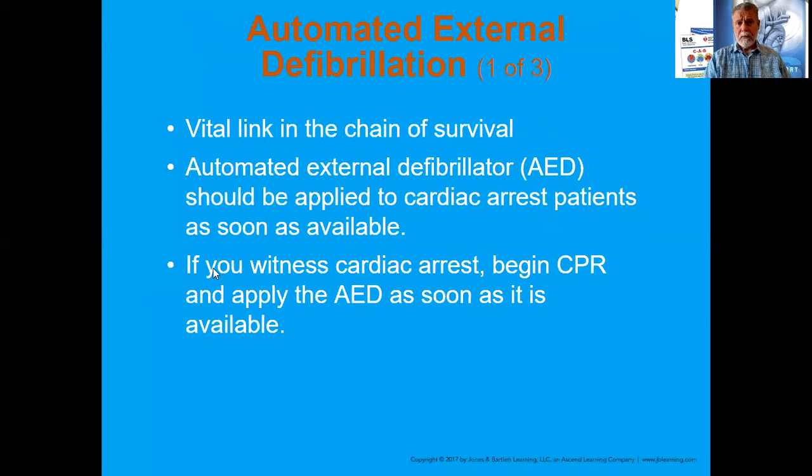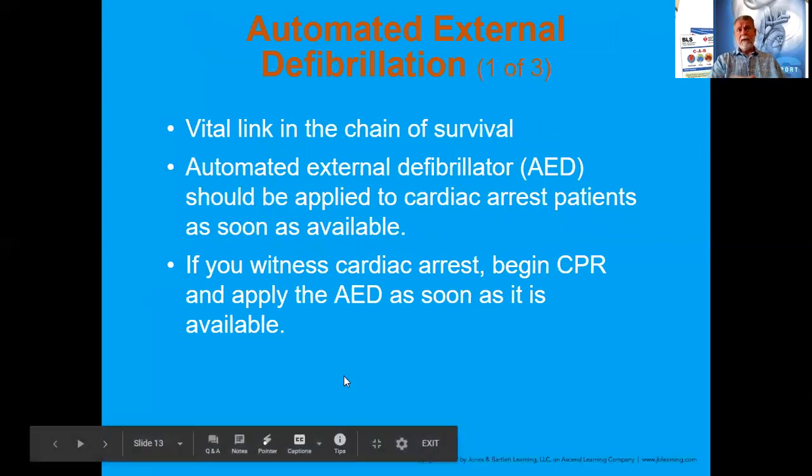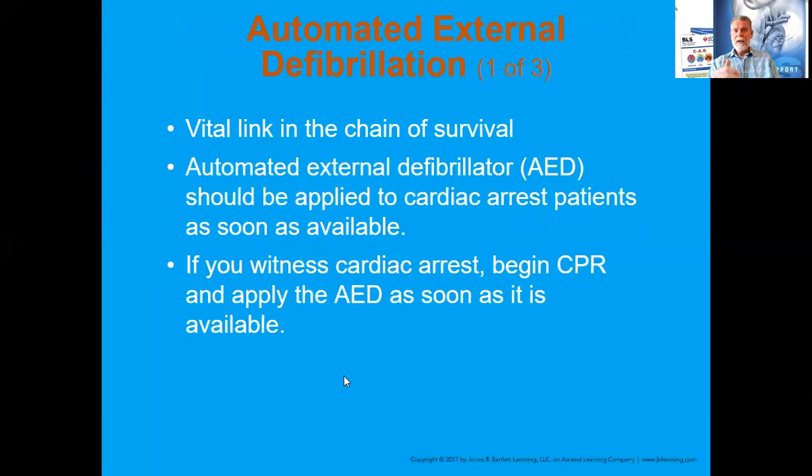The AED, again, we just saw these links are equally as important, but they're all vital links in the chain of survival. But this is truly the device, and if I refer back to the AHA test of what the AED can do, it has the potential to eliminate the abnormal heart rhythm. That's great, because the only time the AED is going to work is when your patient's in ventricular fibrillation or ventricular tachycardia.